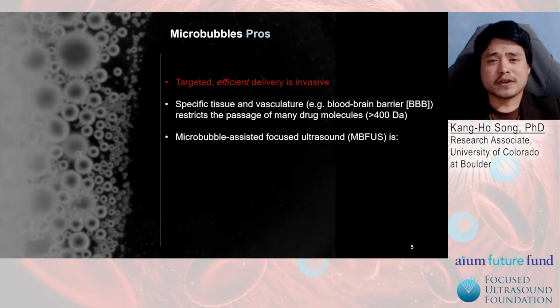But to start on the official pros list here, the very first pro of MB-FUS is how efficient it can be. With microbubbles and focused ultrasound, even newcomers to this technique still manage to achieve the desired therapeutic result, even if the only thing they have is a rough set of initial parameters. So I think that's really unique to MB-FUS in the field of drug delivery.